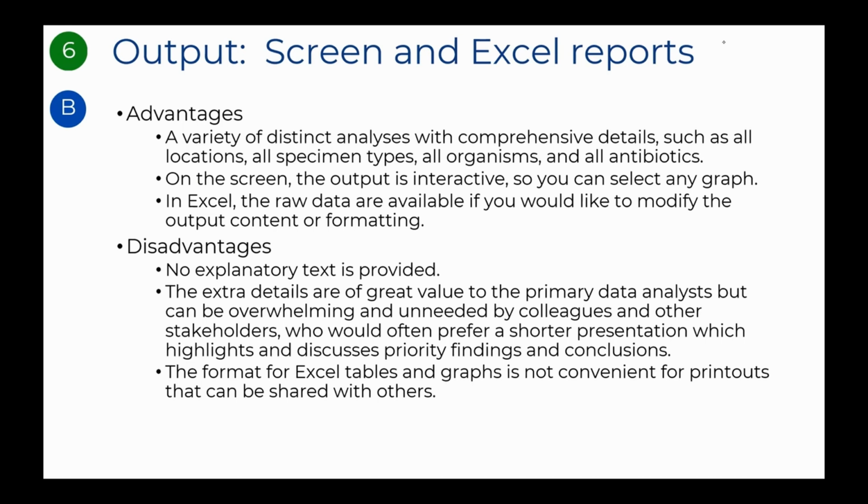But there are also disadvantages. No explanatory text is provided. The extra details are of great value to the primary data analysts, but can be overwhelming and unneeded by colleagues and other stakeholders who would often prefer a shorter presentation which highlights and discusses priority findings and conclusions. Also, the format of Excel tables and graphs is not convenient for printouts that can be shared with others.